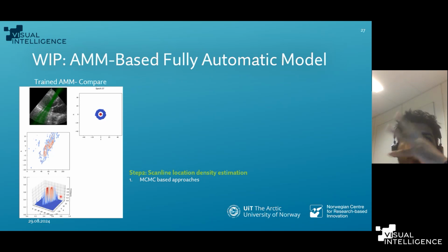So there are multiple correct answers, but the model tries to find some sort of region. The shift-based region is somewhat correct because it is detecting the mitral valve tip. And now we need to correct the rotations also, because it thinks that around 30 pixels, it should be shifted 30 pixels from here, where the scan line should be placed for doing left ventricle measurements.